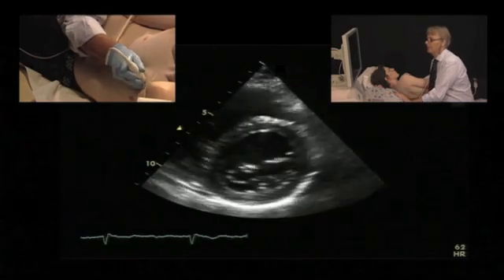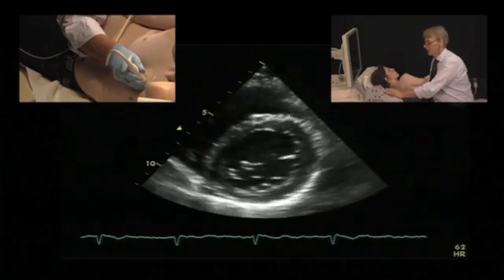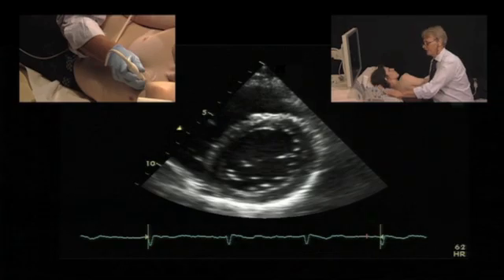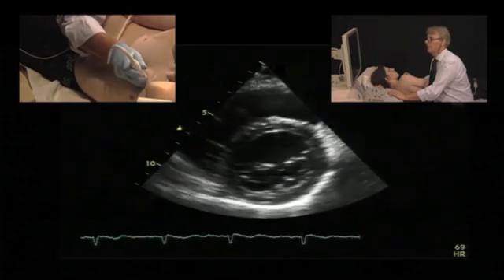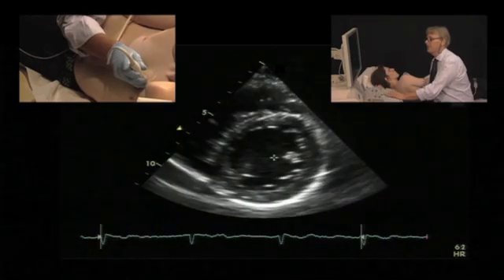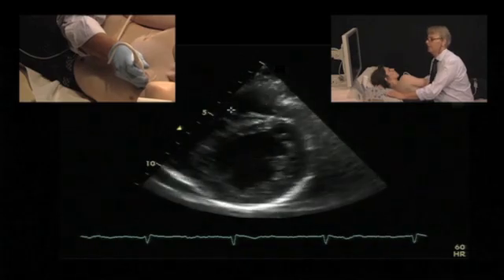If I tilt further down, I would leave the mitral valve, but I would still see structures, but these structures are not the valve, but they are the tendinae which are attached to the papillary muscles. So all these little structures here. Then I would move further down, and all of a sudden I would see the papillary muscles. Those are these structures here. And I would also see the right ventricle with the moderator band right up here. Okay, this is the moderator band.